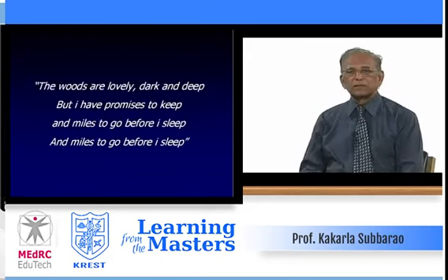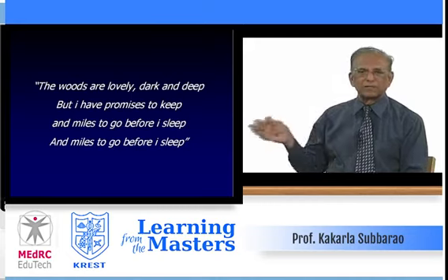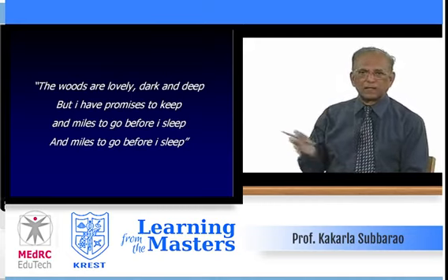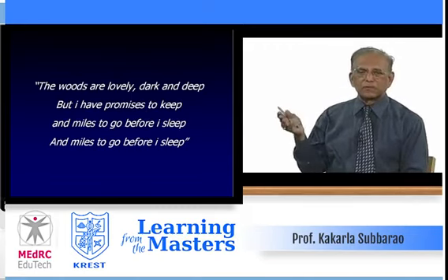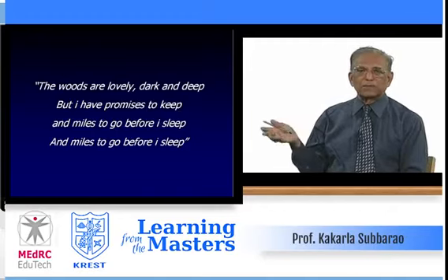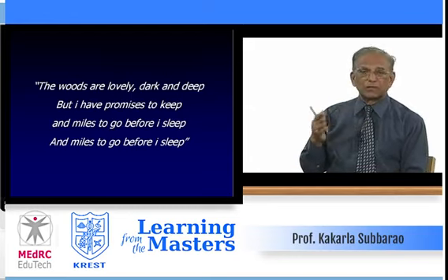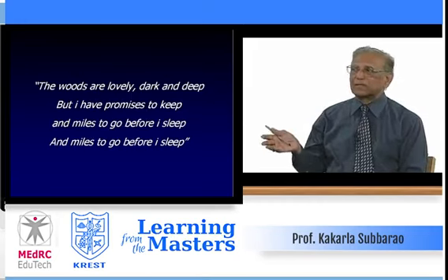So, ladies and gentlemen, it is a long talk. And yet, I haven't covered most of the entities. The rest of the speakers will cover other things such as genitourinary tract tuberculosis. I have confined myself mostly to the bones because osteomyelitis to diagnose early is very important. I have stressed upon that. And lung infections, some of them common, some of them are rare. Tuberculosis of the lungs, somebody else is going to talk. That's why I have not covered.